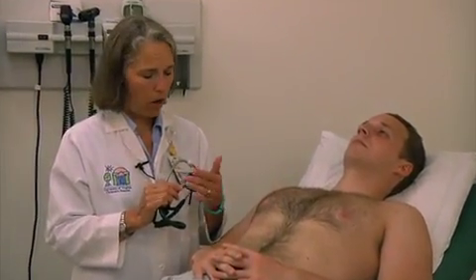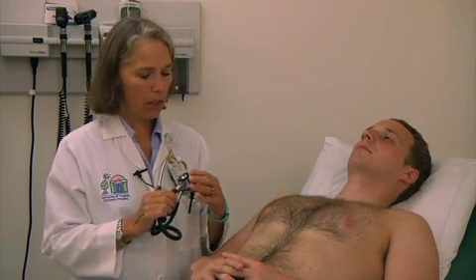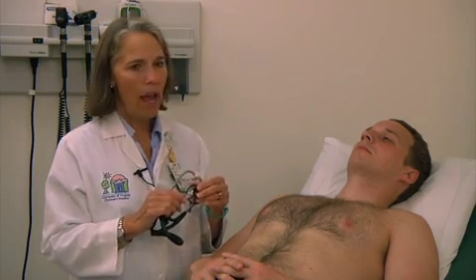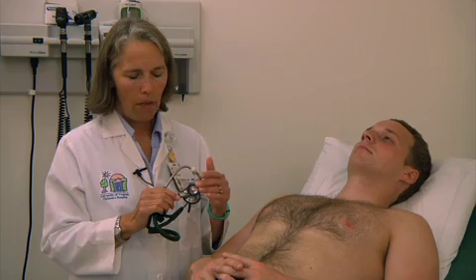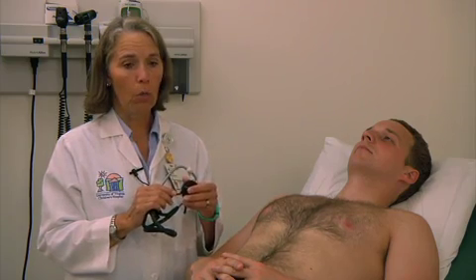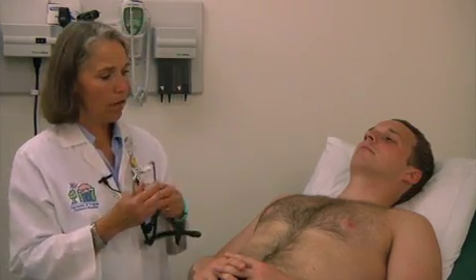For general cardiac auscultation, the diaphragm is what you're going to use most of the time. This gives you a wide range of sounds that you can hear. The bell is good for lower pitch sounds. So as you're listening to the heart, you use both of them to assess the heart sounds, but the bell is used for low pitch sounds, and typically gallops are low pitched. They're harder to hear, so you would need to listen there. But for basic auscultation, you really use the diaphragm.